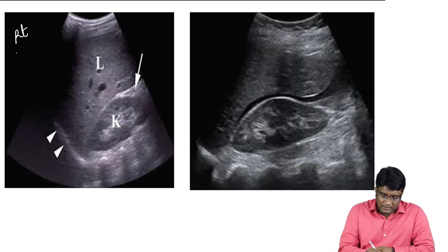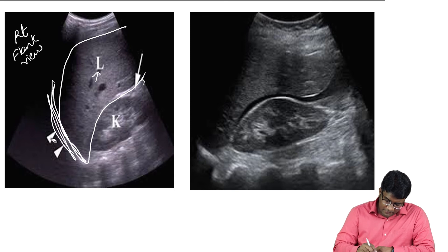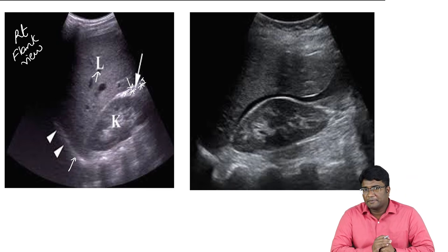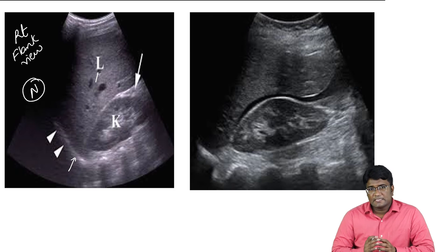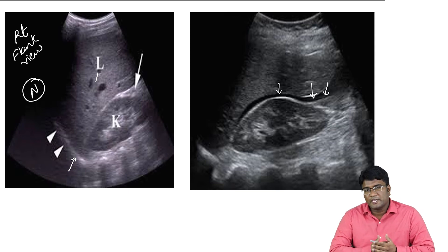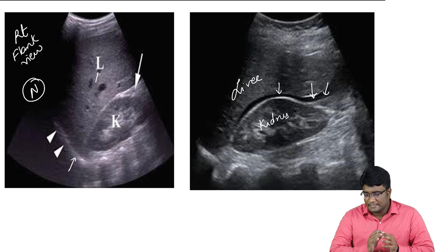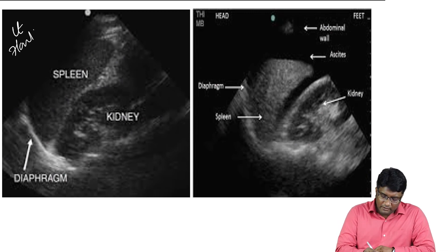On a right flank view, you can see the margins of the liver, the diaphragm as a white area, the parenchyma of the liver, and the kidney. The Morrison's pouch or hepatorenal space is visible here. In a normal right flank view, no collection is seen. If there is a perihepatic collection, a hypoechoic collection is visible in the Morrison's space between the liver and kidney — indicating a FAST positive result.